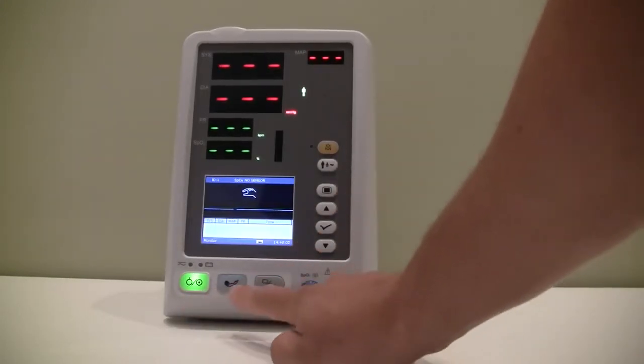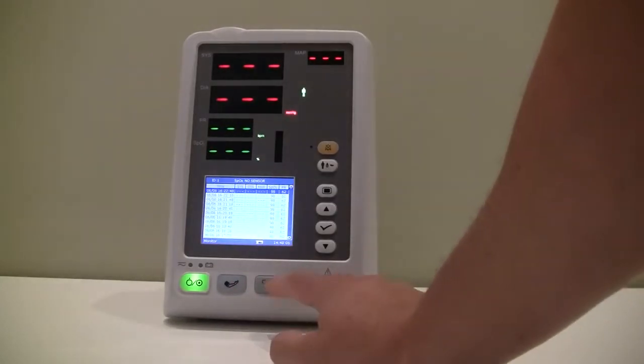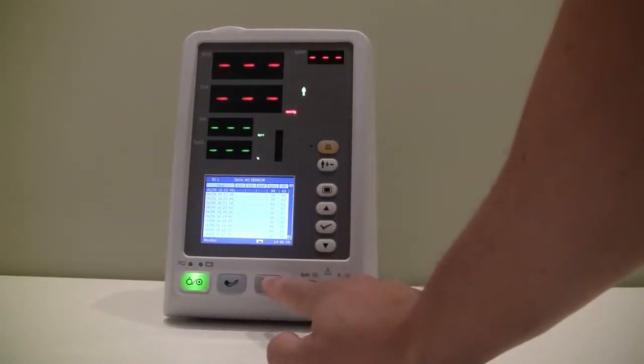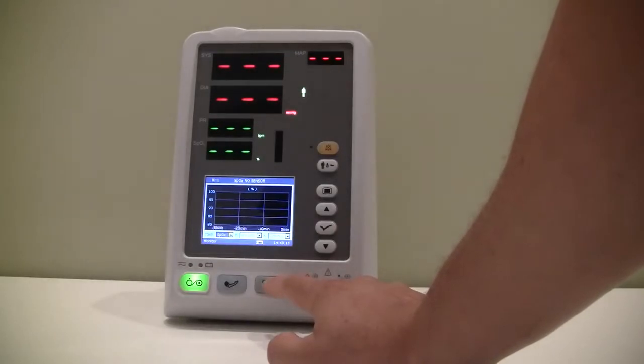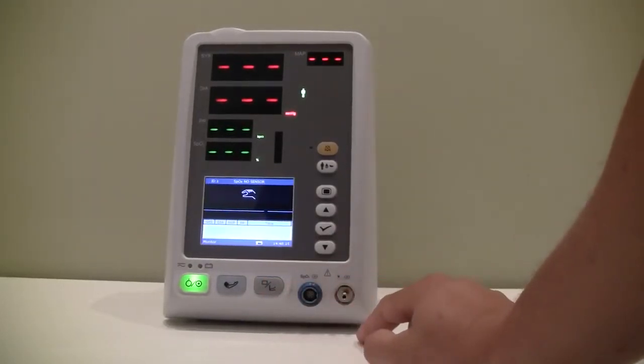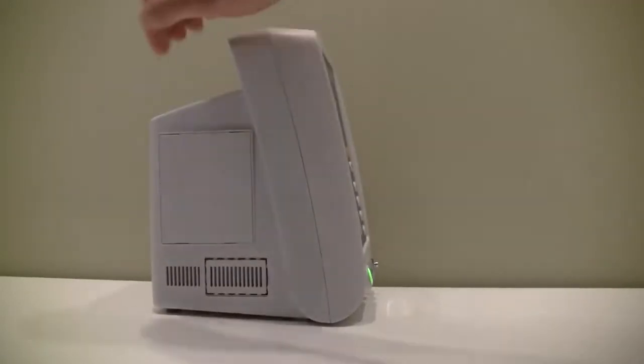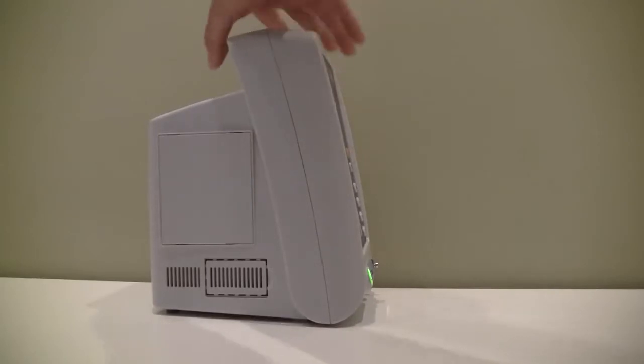Your power button, this is for your manual NIBP reading, and this button here will switch to your trend data in the form of a table or in graphical format. Here's your SpO2 connector and your NIBP cuff connector. This particular unit doesn't have the optional printer on it, which would go here.